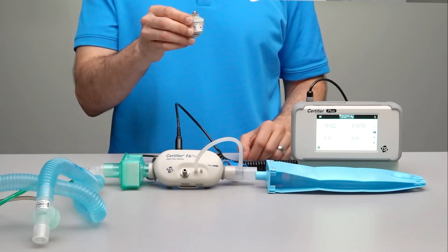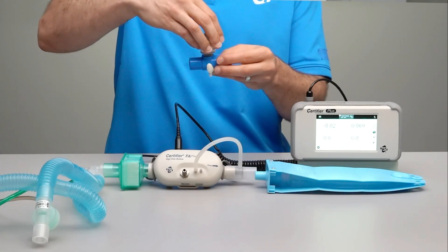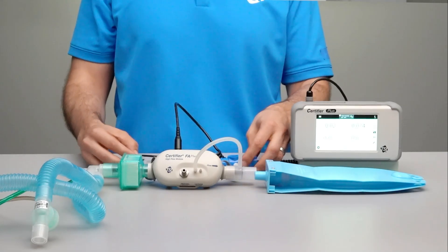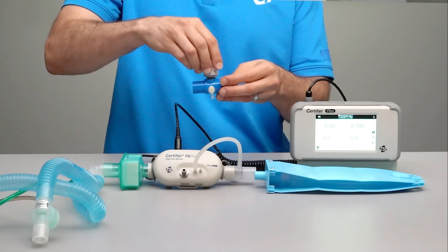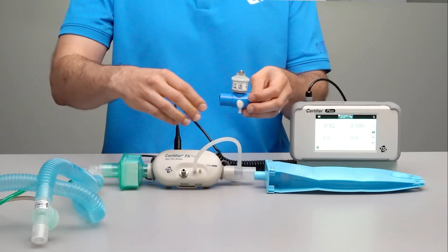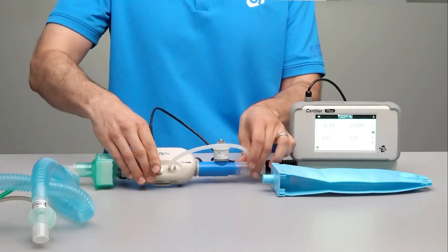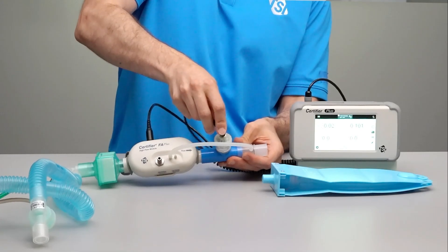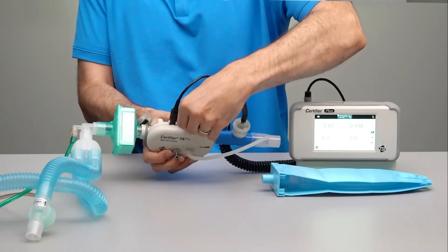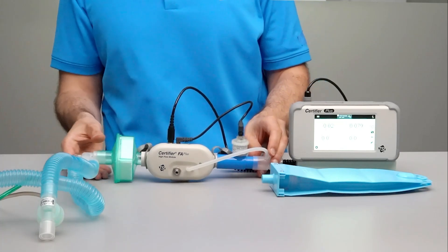The oxygen sensor is used to measure the real-time oxygen concentration of gas flowing through the Certifier. The oxygen sensor works with the high flow module and it can be connected or disconnected at any time without disrupting the operation of the Certifier. To connect the oxygen sensor, screw the sensor cell into the airway coupling and attach the coupling to the test circuit, then connect the cable from the oxygen sensor to the barrel jack located on top of the flow module. The oxygen sensor could be installed in the circuit after the flow module or before the flow module between the Y fitting and the filter.